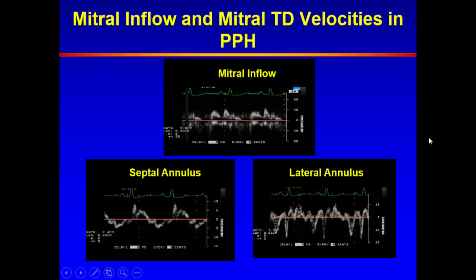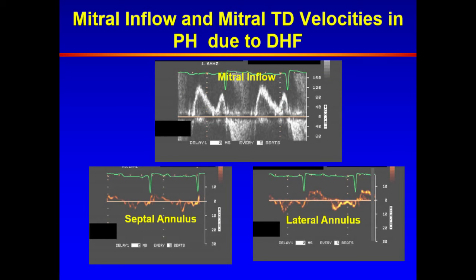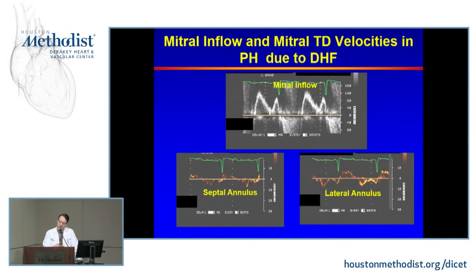So if you're looking at this set of data together, you can say this is likely group one, not group two. This is the situation in group two, someone with, say, HFpEF. An E to A ratio more than one, that's what we call a pseudo-normal filling pattern. Look at the septal and the lateral velocities, both are reduced. We are assuming that we have good alignment here, and that technical issues with improper alignment leading to spuriously low values are not in play. I bring up this point because as we acquire and analyze studies, we have to be careful and scrutinize carefully the signals that we get.